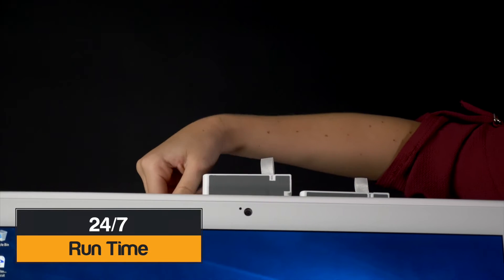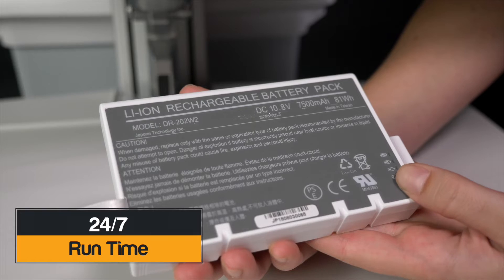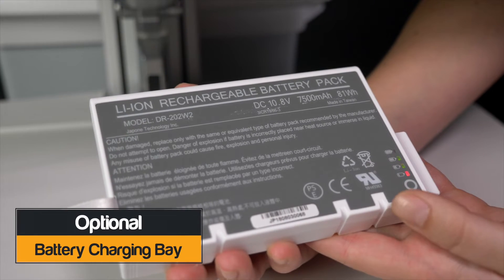It has easy to manage battery usage with a LED indicator light, and it can also be powered using just one battery.